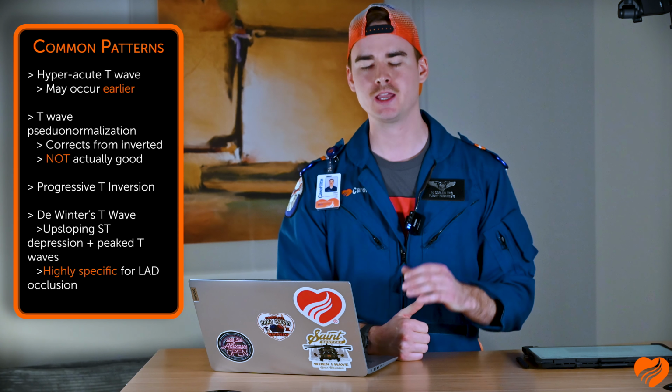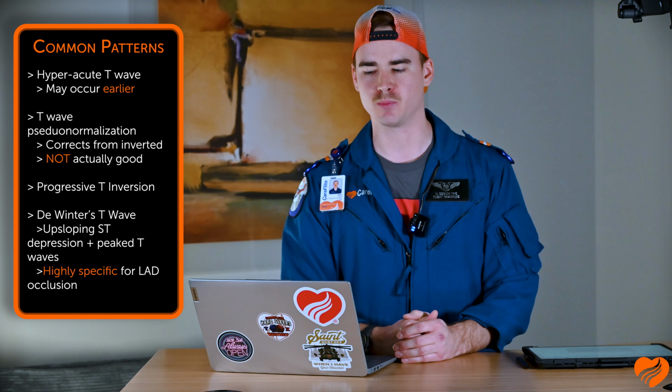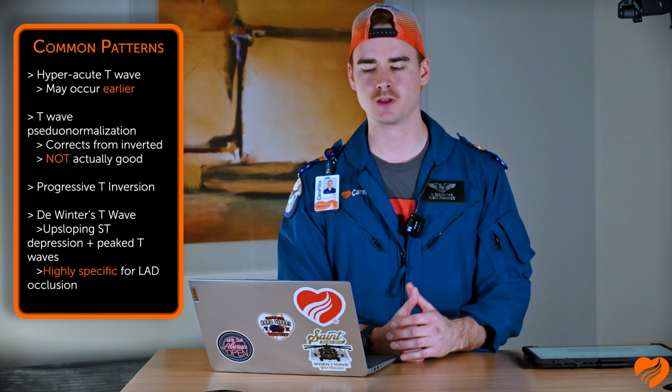You may also have progressive T-wave inversion, taking those initially very tall peaked T-waves and later inverting as that infarct progresses. Going into very specific and named patterns, such as DeWinter, that includes upsloping ST depression, paired with tall peaked T-waves in the precordial leads, and these are very sensitive or specific for LAD occlusion.